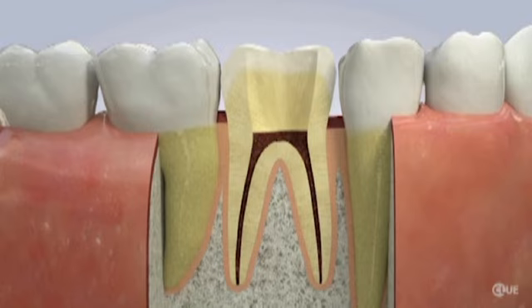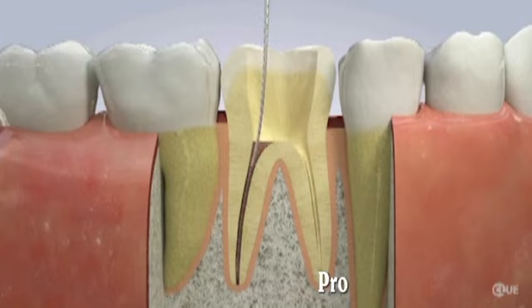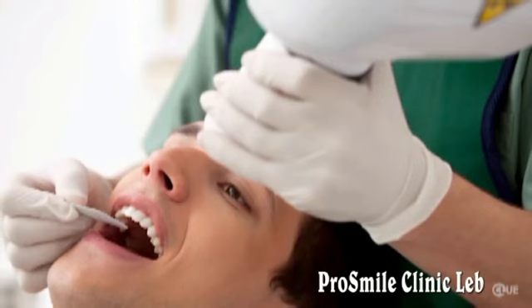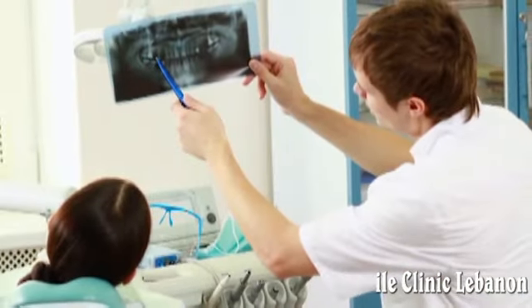During a root canal, the pulp is removed from the tooth by making an opening at the top of the tooth. Drills are used to remove decay and expose the canals. A series of files and other instruments are used to clean and shape the canals of the tooth in order to prepare the tooth for a final filling material. X-rays may be taken during the procedure to inform your dentist of the ongoing process.